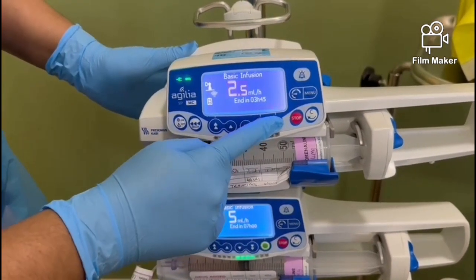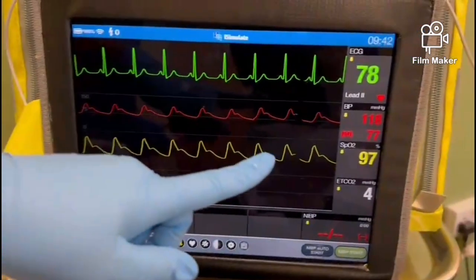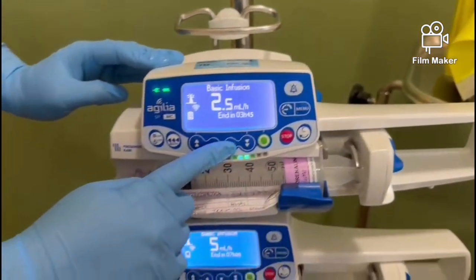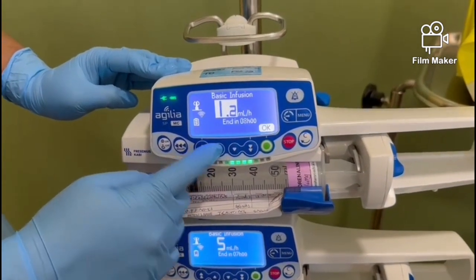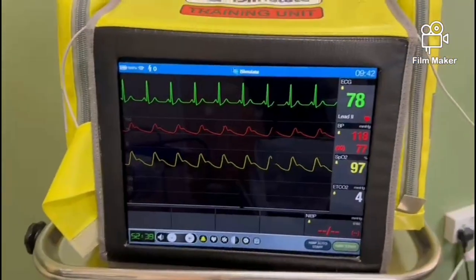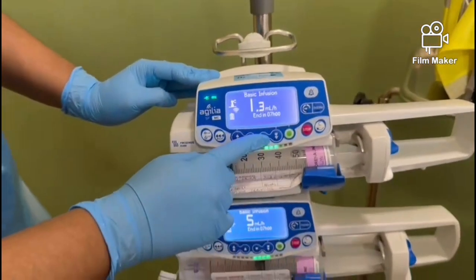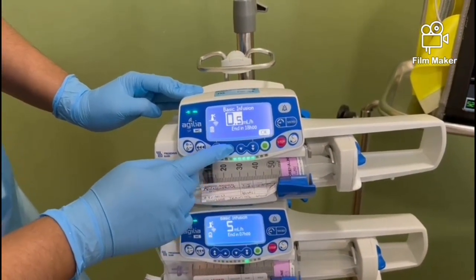As we are double pumping, we will not be stepping away from our patient whilst we monitor the blood pressure. Once you reduce the rate and you continue to see a rise in the blood pressure, we will continue to halve the rate of the old infusion. Our blood pressure continues to rise, so we will continue to halve the rate of our old infusion until we manage to turn it off.